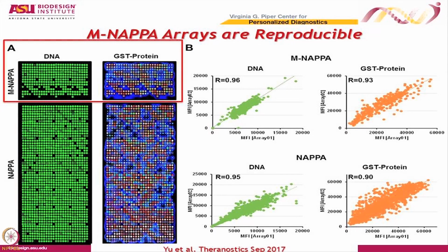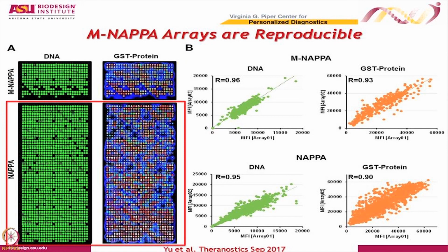Each of these spots contains 5 proteins apiece. The same proteins that are here are down here as individual proteins. So this was an experiment we set up so that we could compare how single individual proteins express compared to the mixed proteins, because we're still trying to test the notion that the multiplex NAPPA will give us the same result that we were looking for.